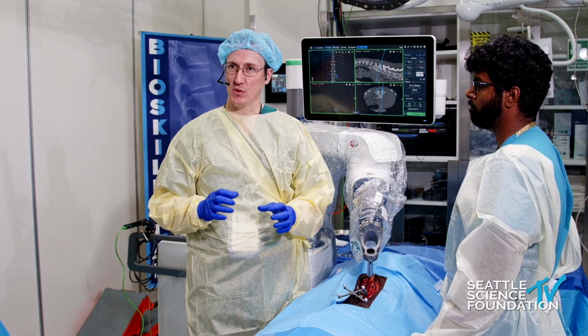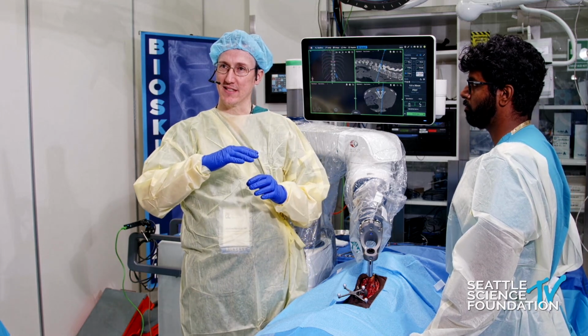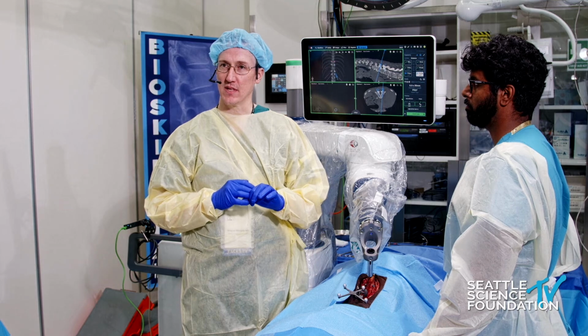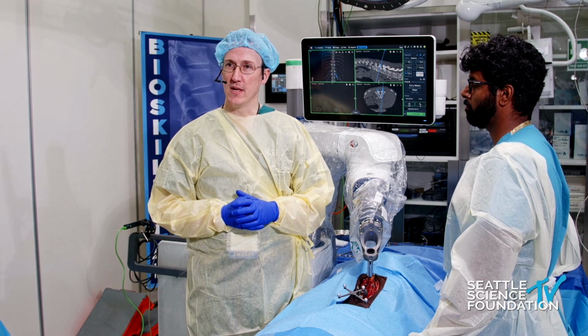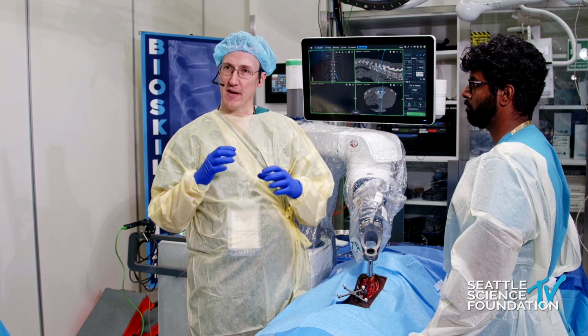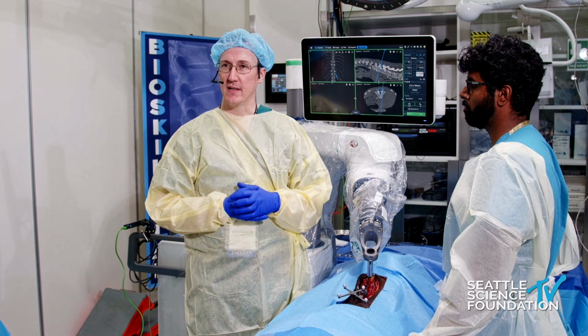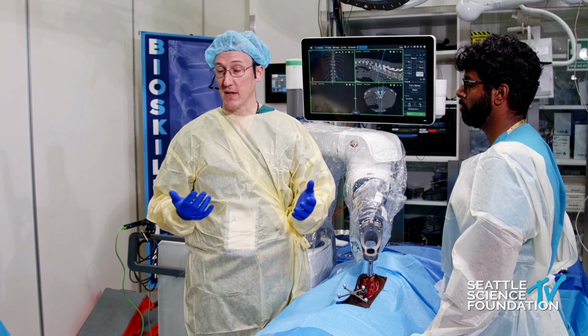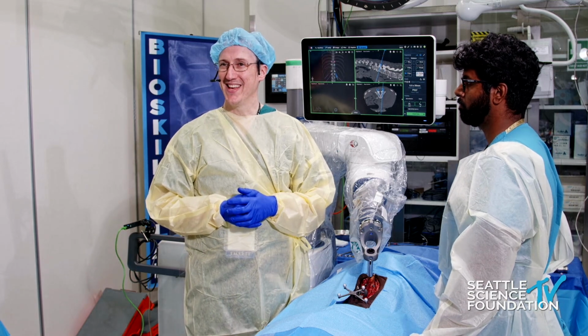Really engaging the cortical bones. The cortical bone just in that subchondral section underneath the disc itself, as well as within the pedicle itself. If you can capture that, your chances are pretty good. And we've heard some of the other speakers talk about maximizing your pull-out strength by going more in a lateral to medial position. And I think those are all really good points and things that I try to engage in.